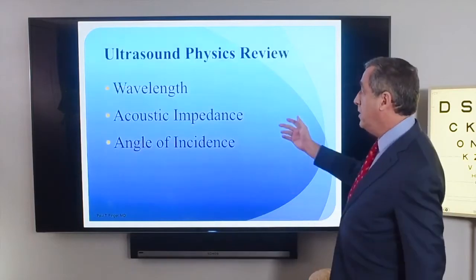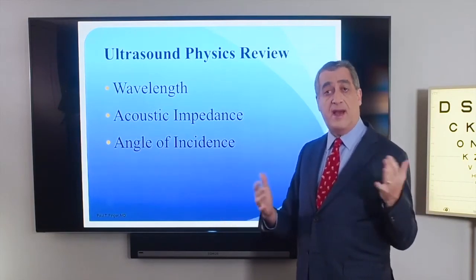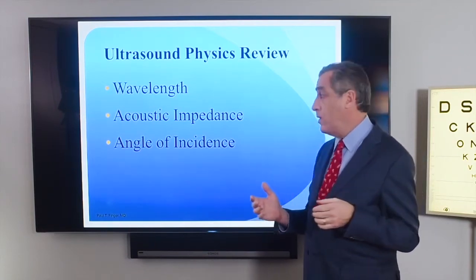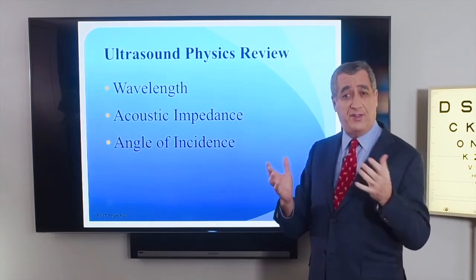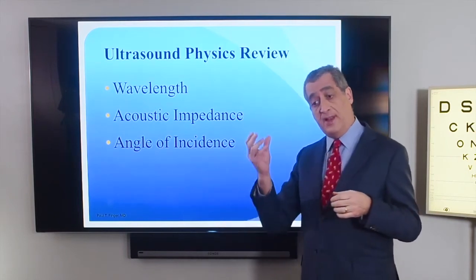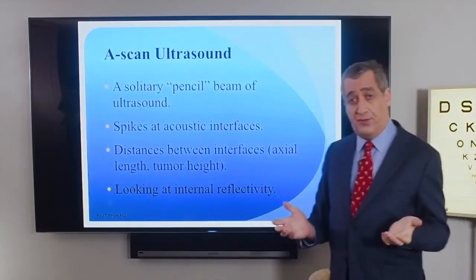So in review on ultrasound physics, we have wavelength, where the longer wavelengths are used to look at the back of the eye or the orbit. Higher frequencies are used to look at the front of the eye, the ciliary body, the cornea, and iris. Acoustic impedance, which is the relative density of materials, which can affect the image that we're looking at. And the angle of incidence is how you place the probe on the eye opposite the lesion to get the best possible image. What types of ultrasound are there?